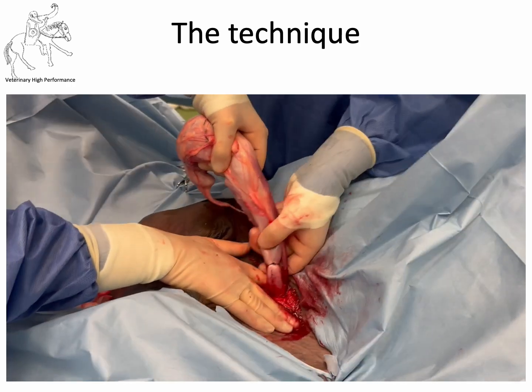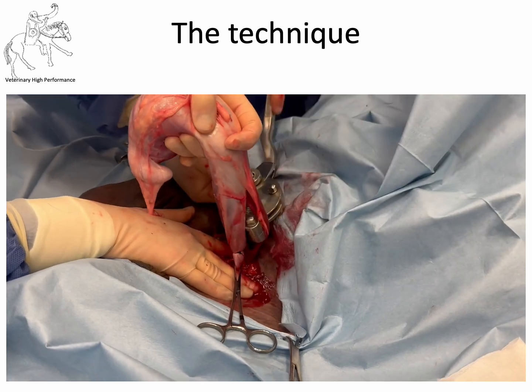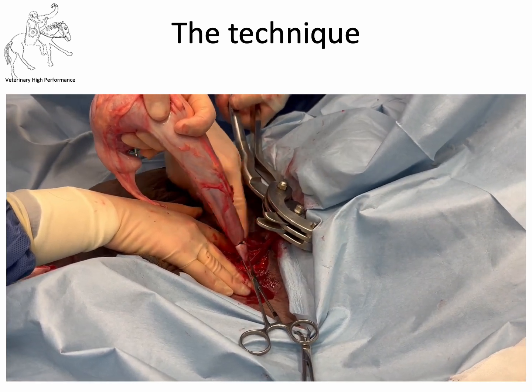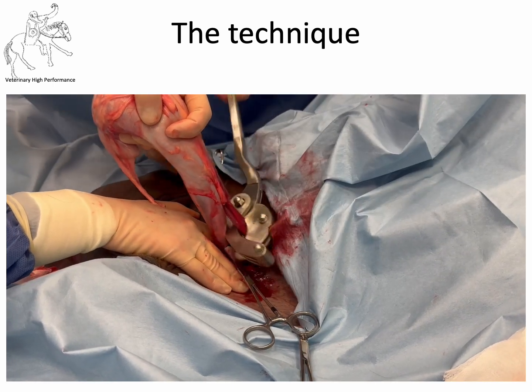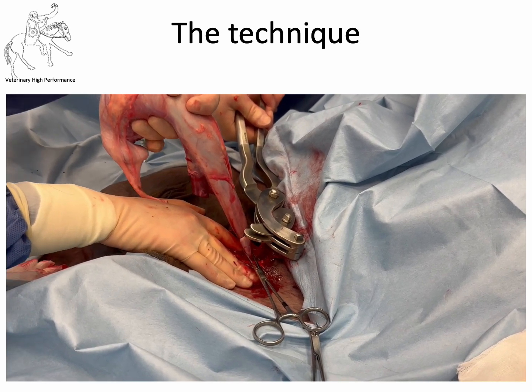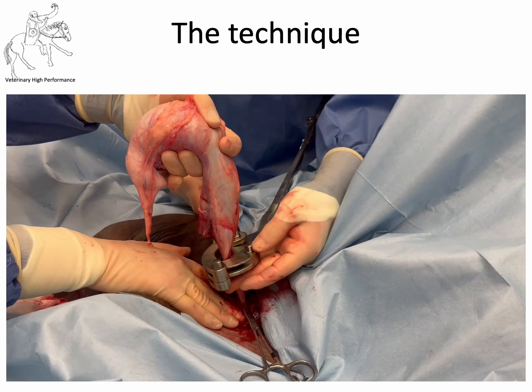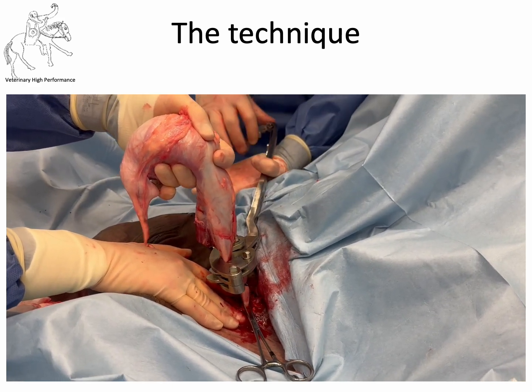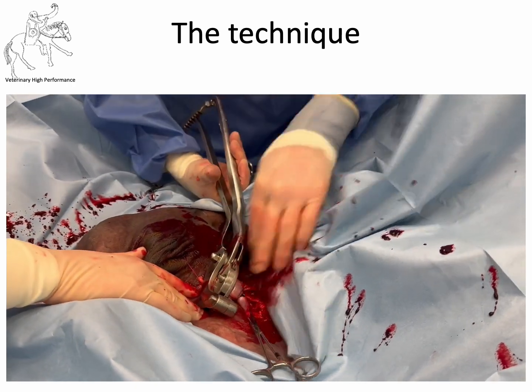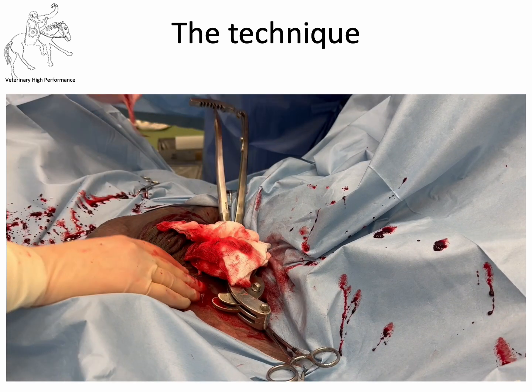Our next step is the use of the emasculator. Put a clamp on the cord below so it doesn't disappear, then bring in the emasculator. First, emasculate the cremaster muscle — about one centimetre above where the ligature was placed — and hold that in position. Then do something similar with the cord itself. A little word about emasculators: they need to be well maintained and checked before use. They're applied traditionally nut to nut — the nut being the testicle — meaning the cutting portion is near the testicle and the crushing portion is near the body wall. This is a Serra emasculator with a ratchet clamp to hold it in position. And that is the procedure.